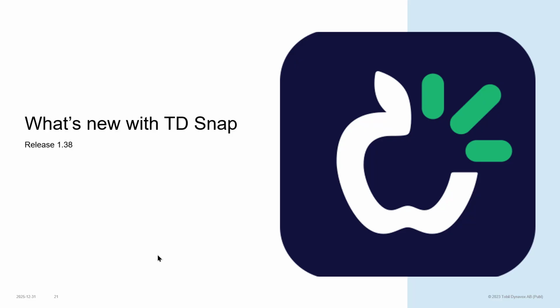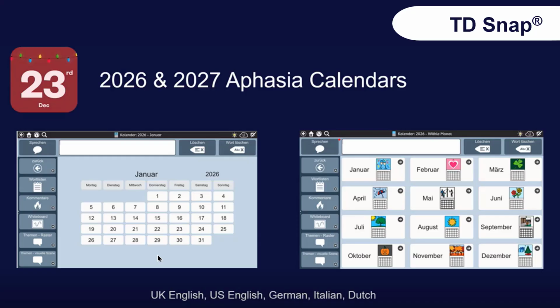Okay, now we're ready to explore what's new with TD Snap. Some things that have come with release 1.38 and some things that have come in recent months, either in early releases or things that have maybe been released on PageSet Central. So a very small piece of news is that we now made the calendars available for the Aphasia page set, available for download in PageSet Central.